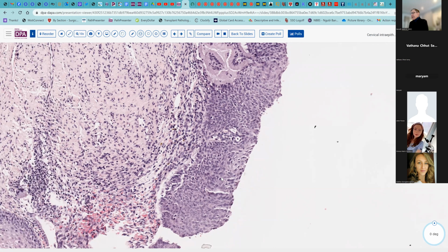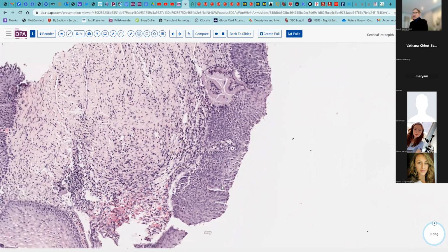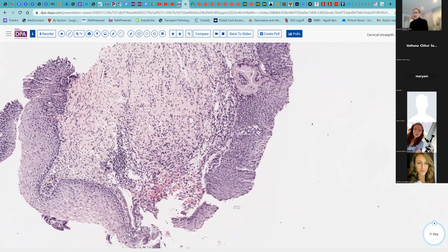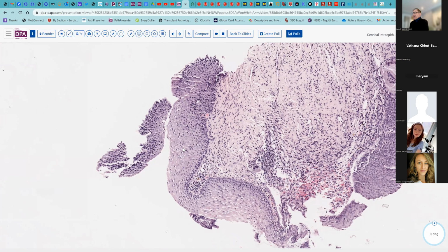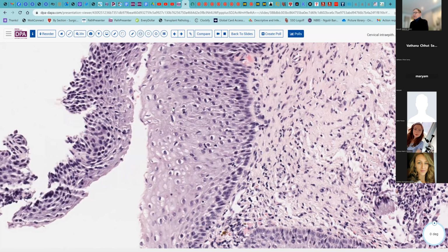And so, from a cytologic standpoint, it's often the amount of cytoplasm that will determine whether something is a moderate dysplasia or a mild or a severe dysplasia or high-grade lesion. But the truth is that these can be quite difficult. Now, the other feature here is that right next door, we do have what looks like some viral cytopathic effect. You know, a little bit of perinuclear clearing, some nuclear enlargement.